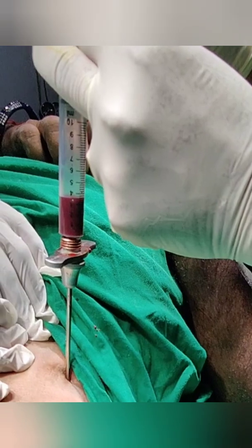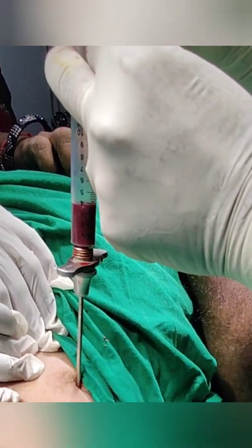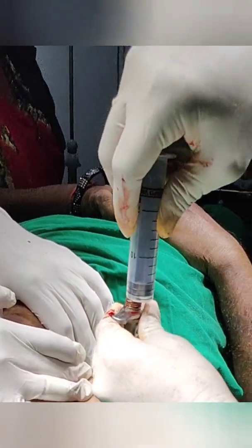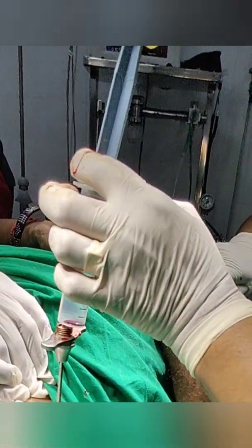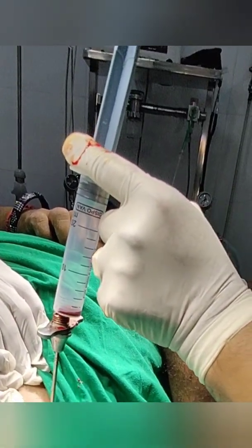Then take a single suture at the site. This can be used as a daycare procedure and the patient can be discharged after 2 hours. In doubt or in delayed union cases, I always use this technique under image intensifier.